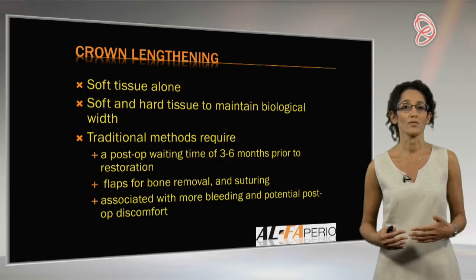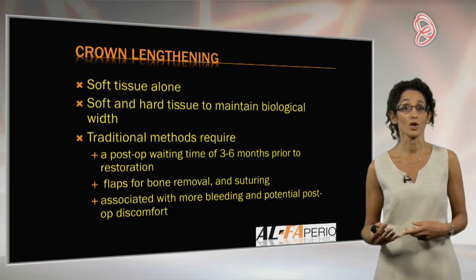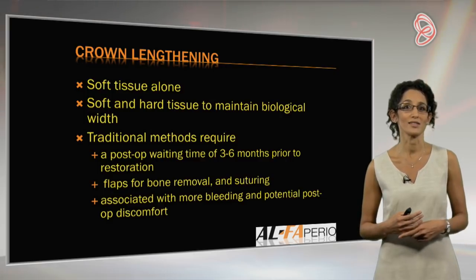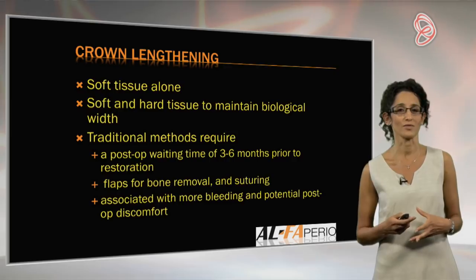So often we then have this temporization phase for several months before patients can go on and have their crowns placed. So that was the traditional method, and of course I'm going to show you lasers, and hopefully you'll see how it can really potentially make a big difference.